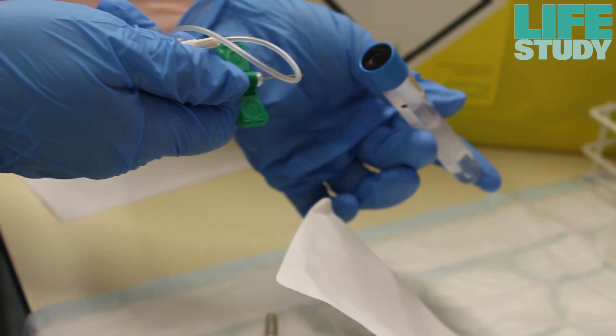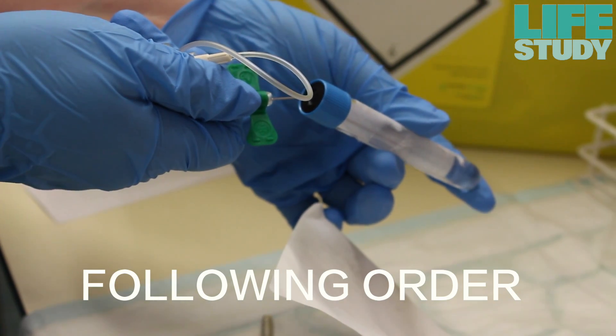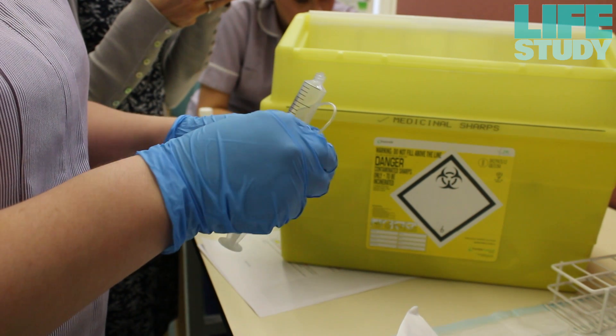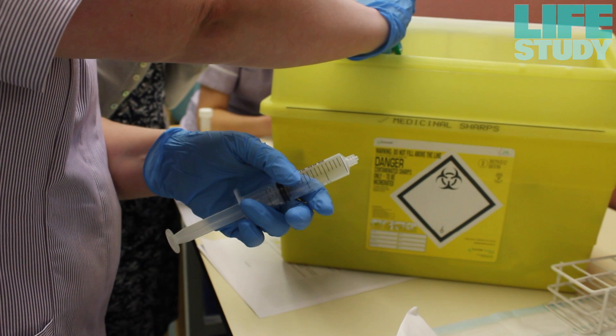Transfer the cord blood into the appropriate blood bottles in the following order. Firstly, the Tempest blood RNA tube with the blue cap. Insert the butterfly needle into the vacutainer and fill the tube with blood and recap. Discard the butterfly needle into an appropriate sharps container.